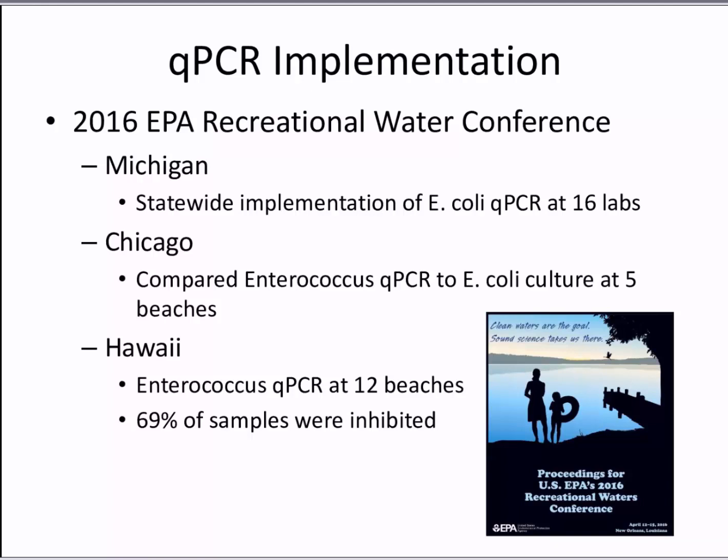Another example is in Chicago, where they compared Enterococcus qPCR to E. coli culture at 5 beaches. Basically, the outcome was that the culture did not correlate to the qPCR, and in fact, they still would have more postings based on the culture method compared to the molecular methods.